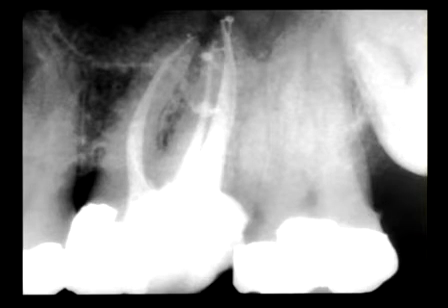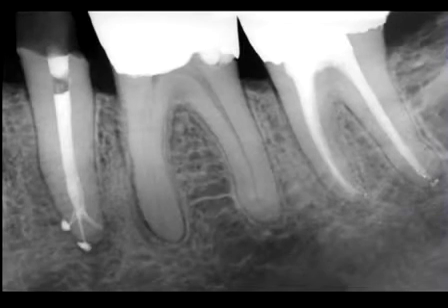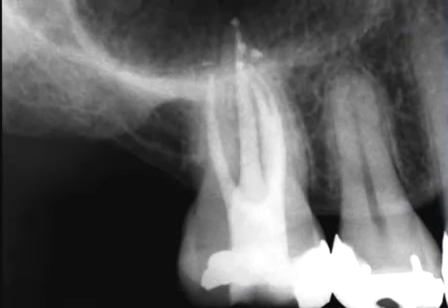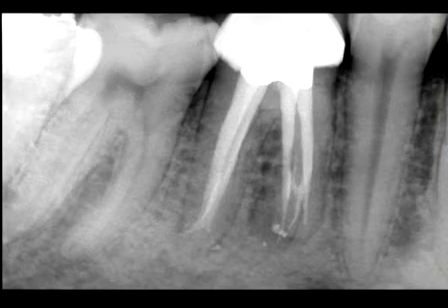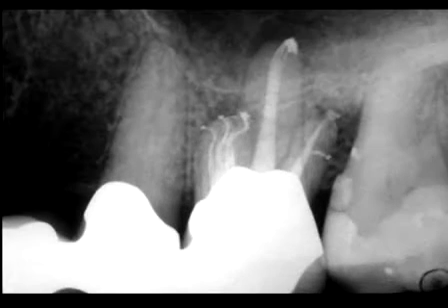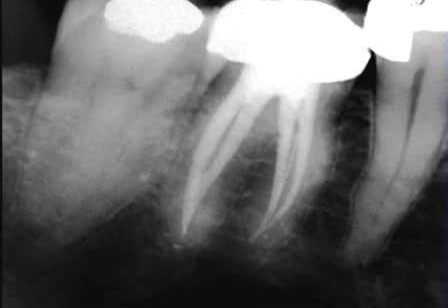Three-dimensional obturation represents the final step that concludes successful endodontic treatment. In the early 1960s, Dr. Herbert Schilder ingeniously created the warm gutta percha with vertical condensation technique. Over 40 years later, significant numbers of well-trained dentists are continuously selecting this obturation technique because it is simple, efficient, effective, and routinely fills root canals in 3 dimensions.